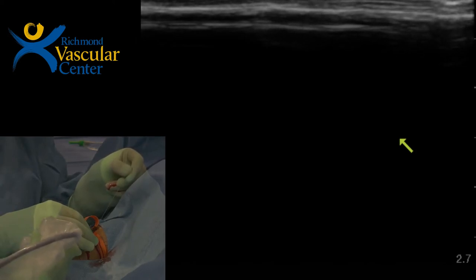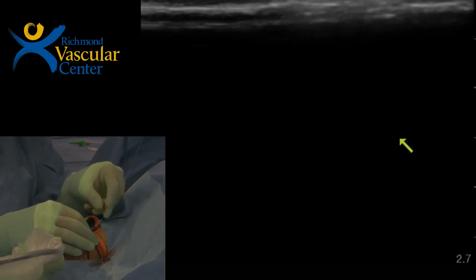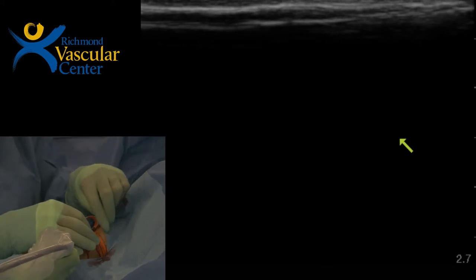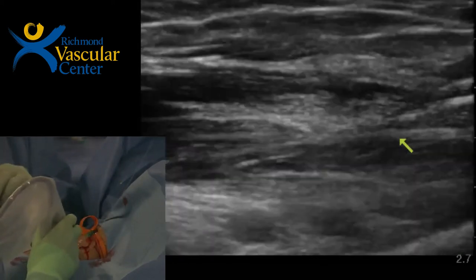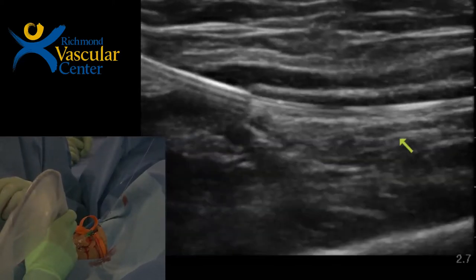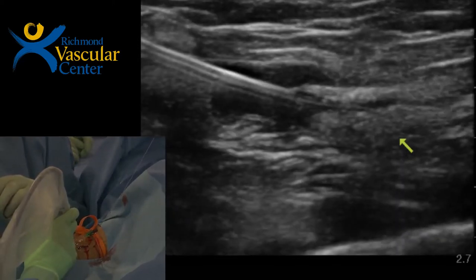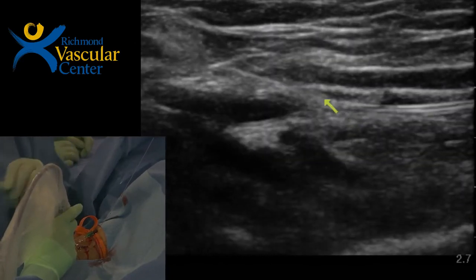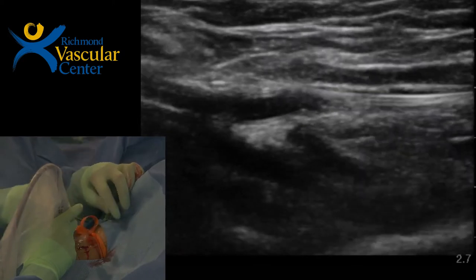A lot of people ask, do you need to have someone helping you do this? And I like it when we demonstrate because you guys can see more. So instead of me putting down the transducer, I'm going to have Wendy hold it for me. And you can see there's our needle right in the artery, and there's the wire coming through. So we'll go ahead and put the sheath in.